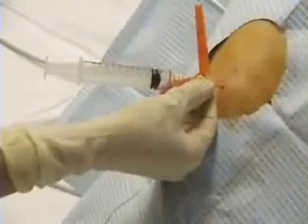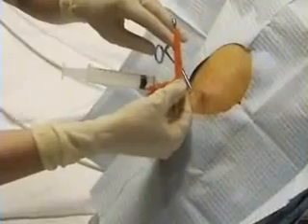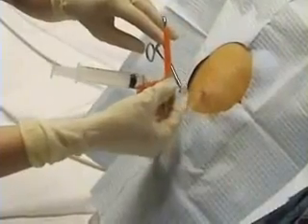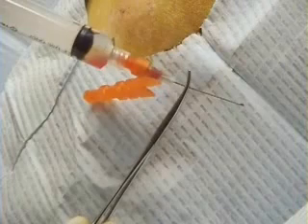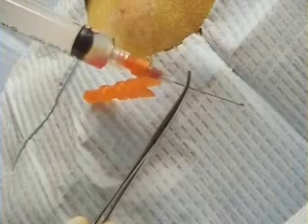Note the depth of penetration and then withdraw the needle. If available, a hemostat may be attached to the exposed portion of the needle to mark the depth of the pleural space.